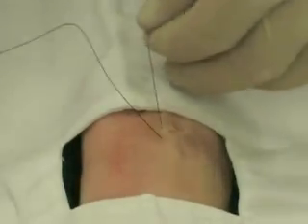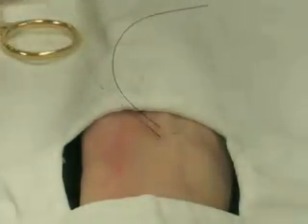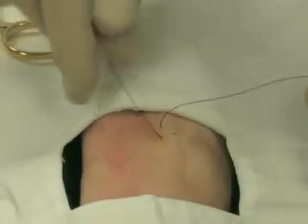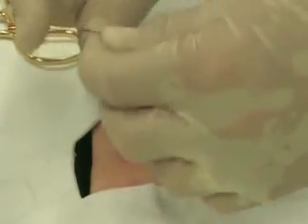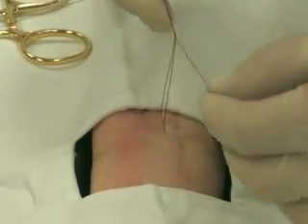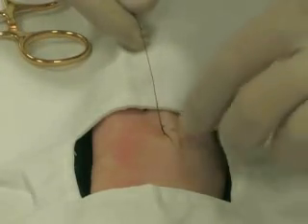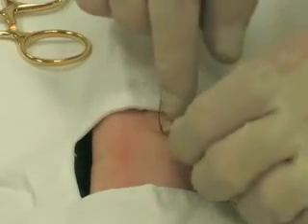Then hold the end of your suture as you pull through so you don't pull the string all the way through, and leave yourself a long enough tag for a two-handed tie. You'll cross the top string above and the shorter string below. With the longer string over your index finger, take the shorter string and pull it over your index finger, rotate your hand, pinch, and then pull, and you'll see how the knot lies flat here. Now, we did not throw a surgeon's knot to start with. We'll demonstrate that in a second.